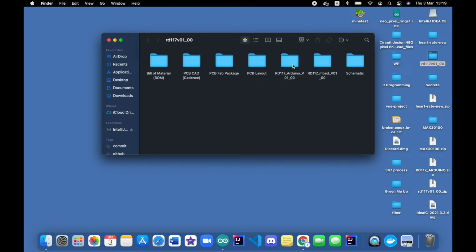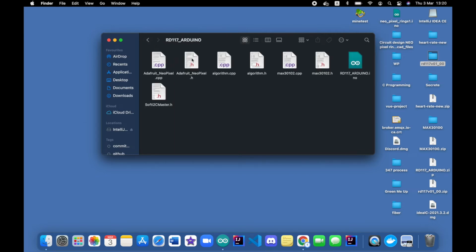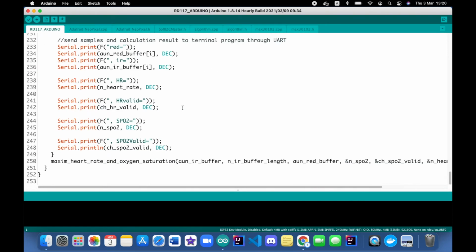It didn't work, and it shows so many different errors. The errors I really tried to solve were errors where it could not recognize things, and whatever I was trying to remove or change would cause many more problems. So I tried this one, and here it has the library and all the necessary parts. When you open it, you see this, but it doesn't work, so don't use it.